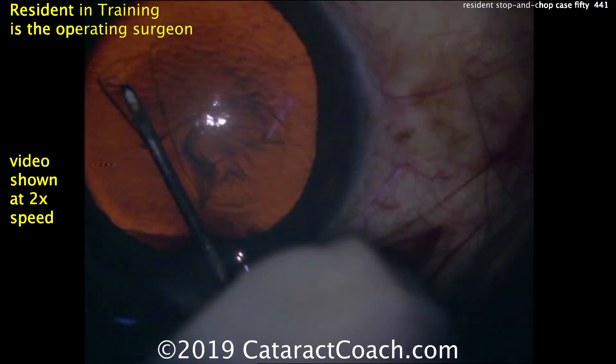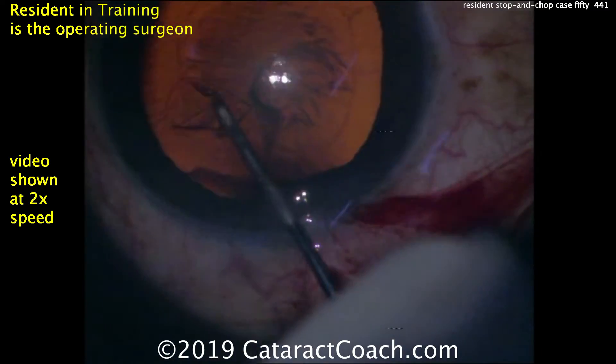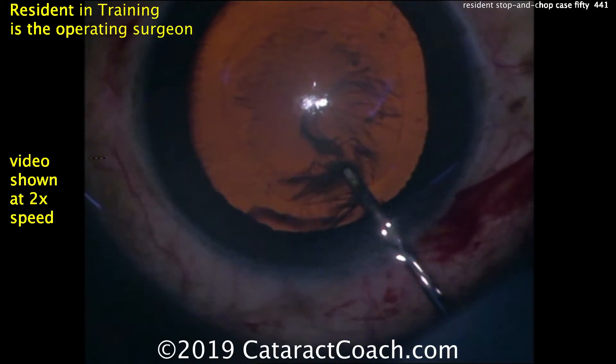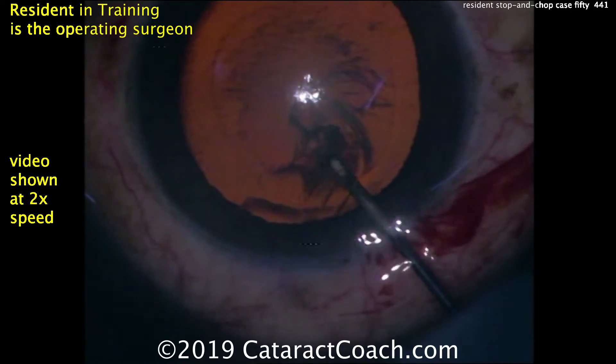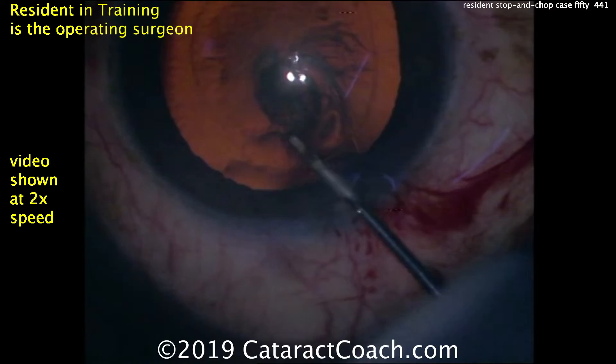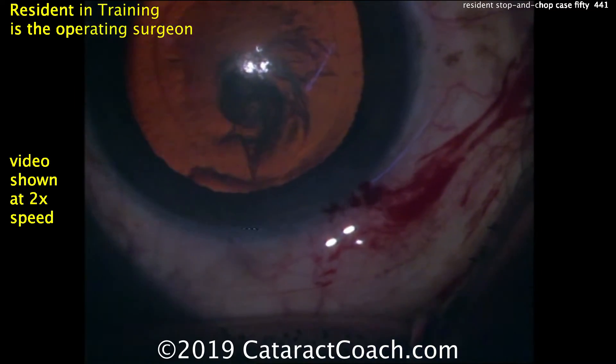The entire rhexis is being done just with the cystotome, and this is a neat technique that really tests your skill as a surgeon — to be able to control that thin capsule with just the friction of the point of your cystotome. That looks like a very nice round capsular rhexis. That went great.